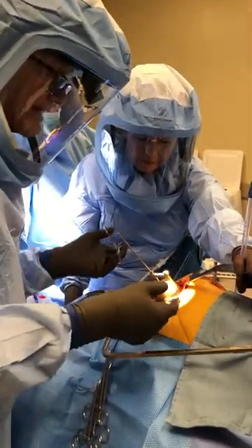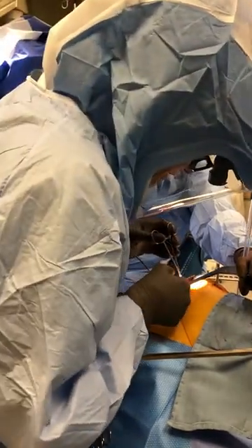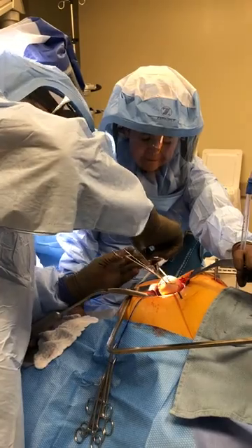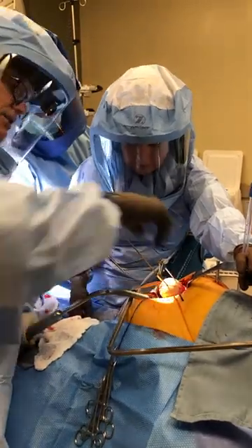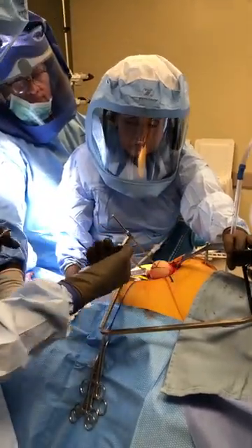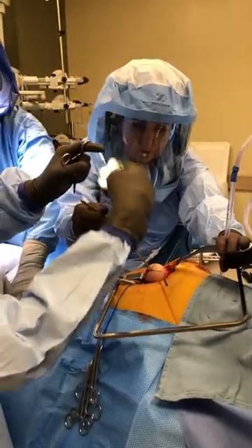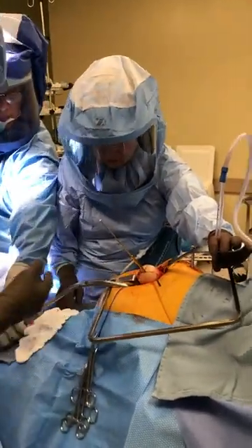So he's got a pretty big head-to-neck ratio. Clear is easily superior — we definitely want to clear. Posteriorly it just clears, and inferiorly it clears. So it's perfect all the way around. I don't check the anterior because the neck is oval, and if the back is close by, I don't need to check there, and I don't want to make a bigger incision to do that.